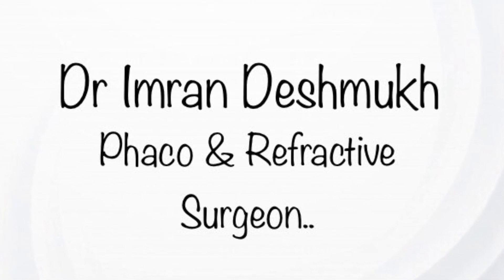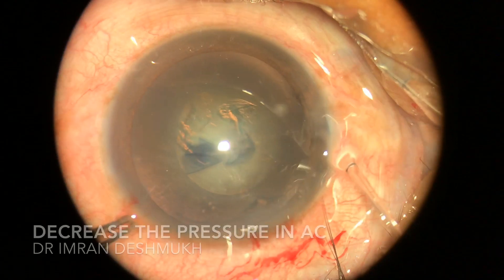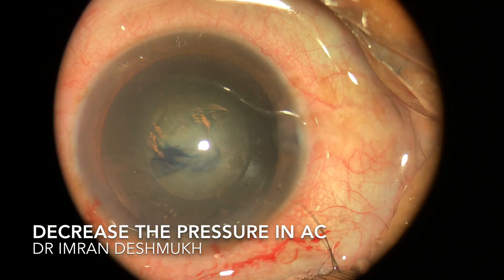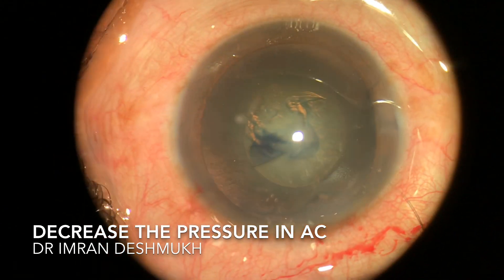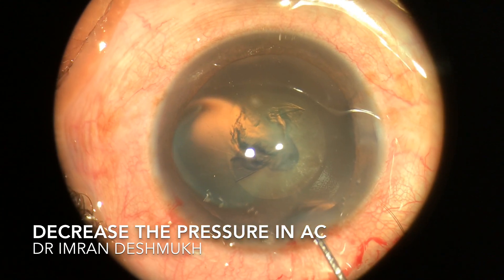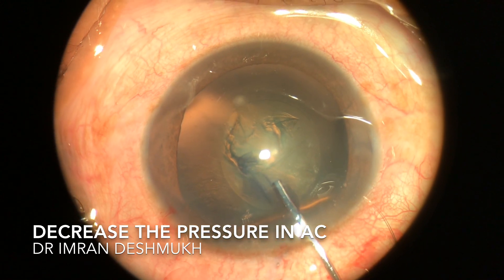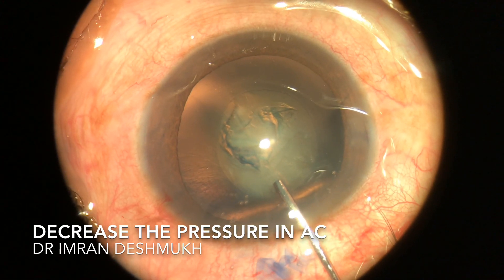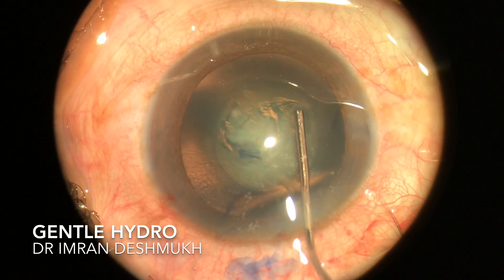Today we'll be discussing how to do hydro dissection during phaco surgery. The first step is decreasing the pressure in the AC before doing hydro. Take the hydro cannula and gently press on the posterior lip of the main wound so that a little bit of visco and the rhexis flap comes out slowly. Go beneath the anterior capsule.